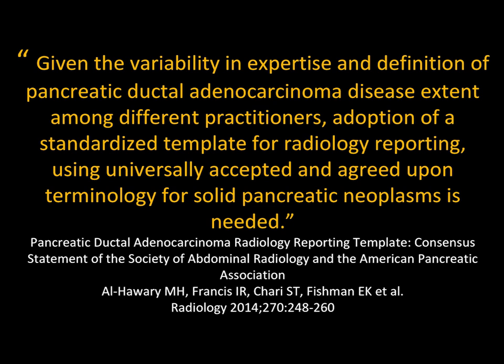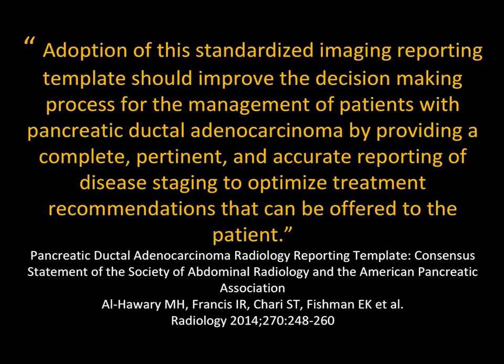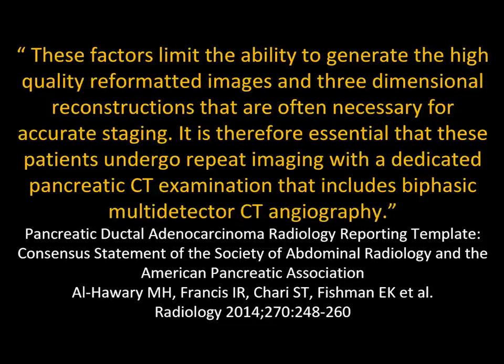And so what became clear was if you want to do templates, you got to do protocols. And so it's very important for us to remember standard imaging reporting templates should improve decision-making, but accurate reporting of disease will also need to have the right protocols. So again, putting everything together becomes important.